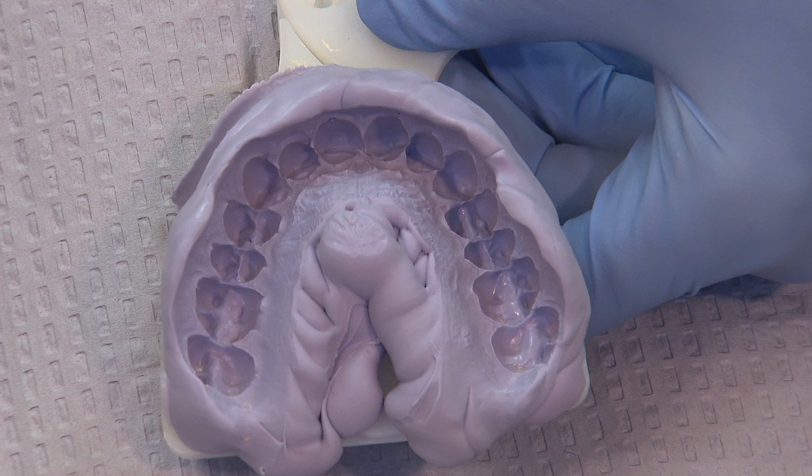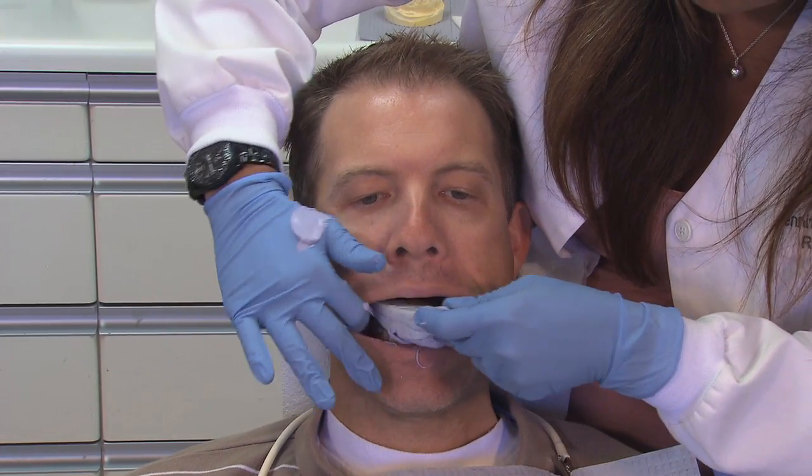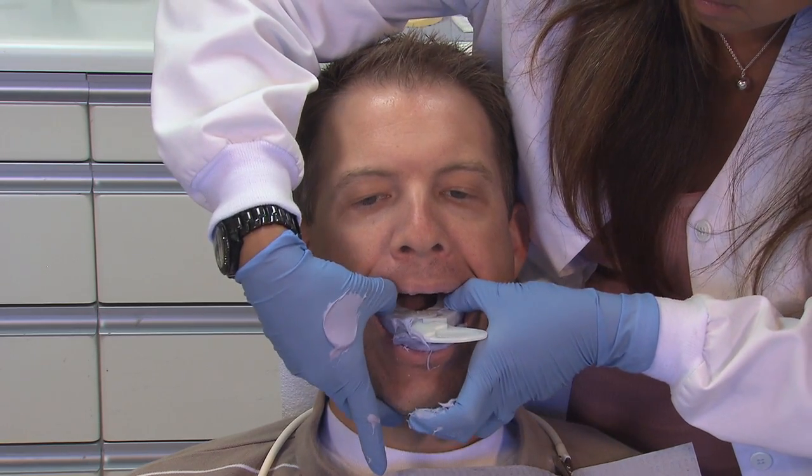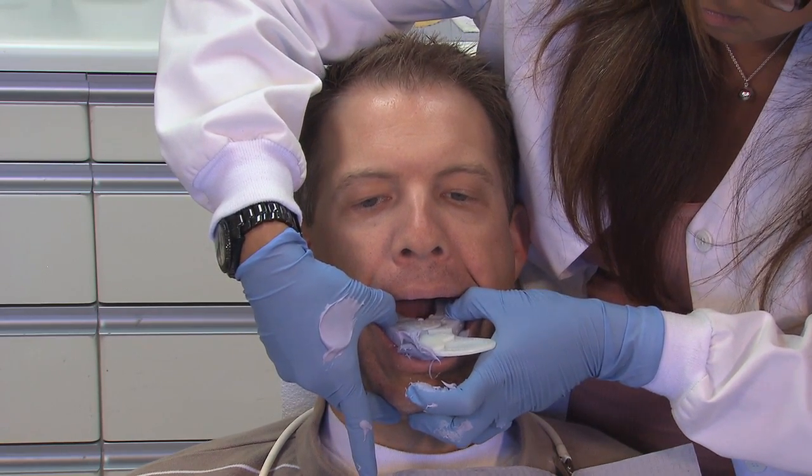That's all we're looking for. These appliances don't go down quite that far. They're really just going to engage the buccal and lingual surfaces of the teeth to about 1 millimeter above the gingiva. They do not extend onto the soft tissue, so we just don't want any major air inclusions on those portions of the teeth.